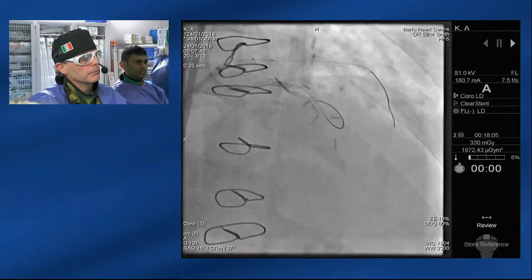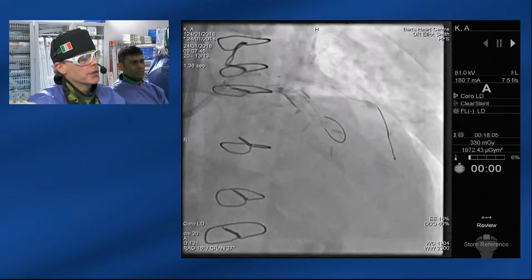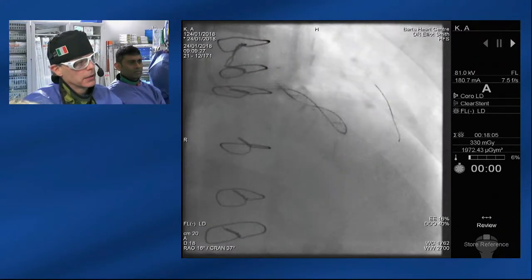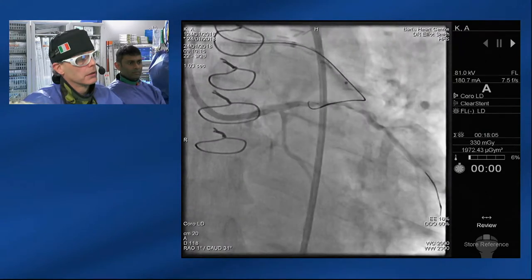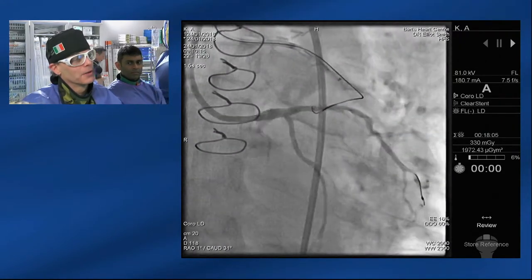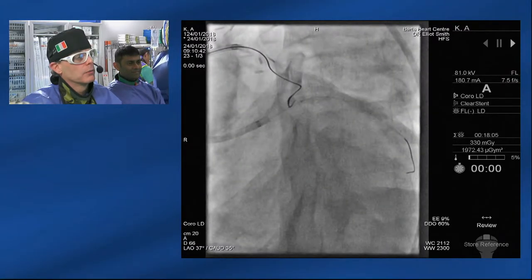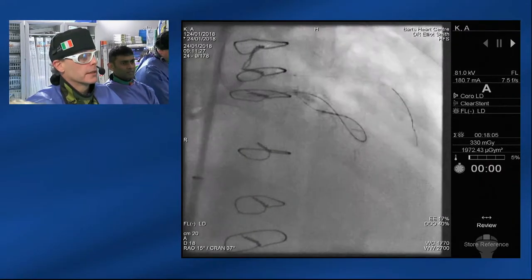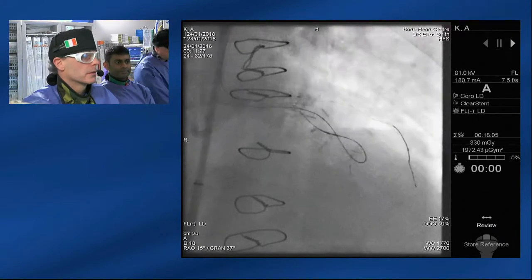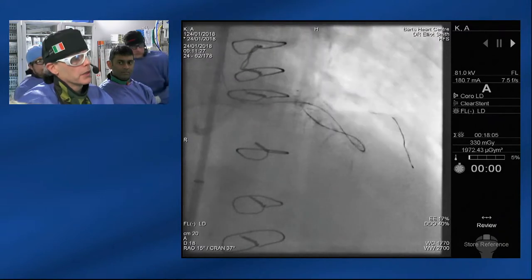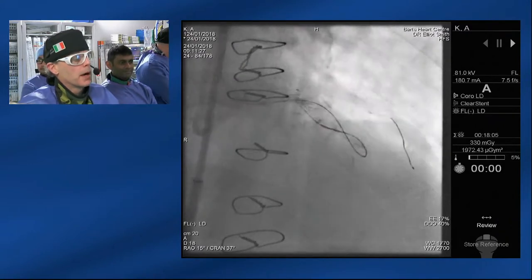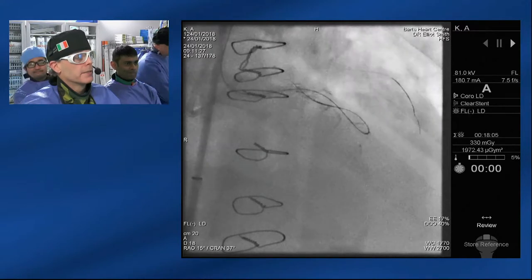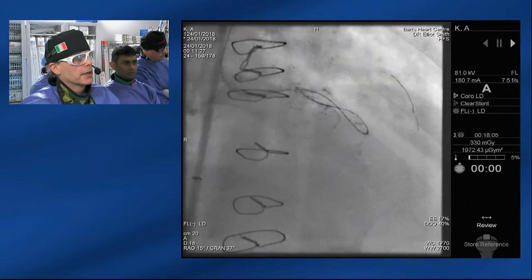Is your first attempt reverse wiring or reverse CART? People are very tempted to do wiring in this scenario because it seems short. But the downside can be sub-intimal wire passage proximal to the occlusion segment, which can result in true vessel compression. With that in mind, we had a very limited attempt with a Gaia 3 wire. We were just a little bit confounded by the anatomy and the angulation, so it was a very short attempt.